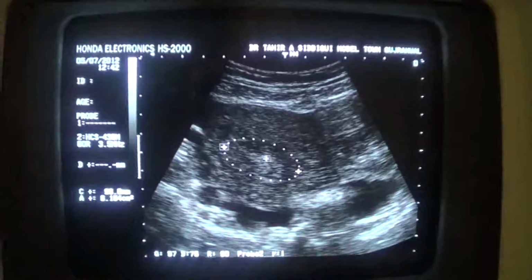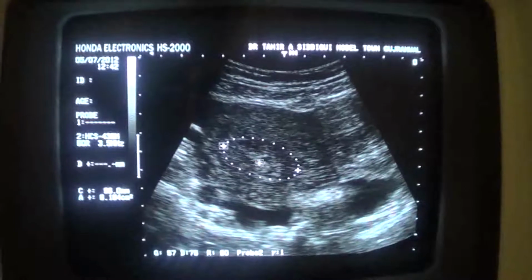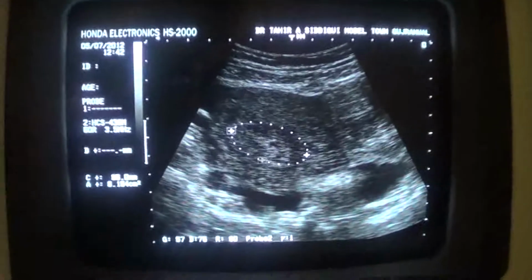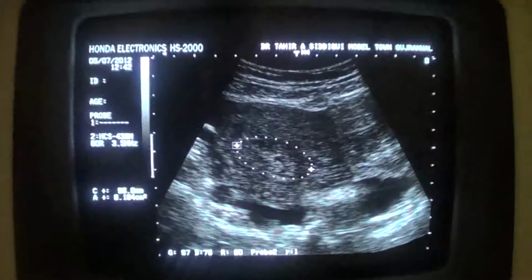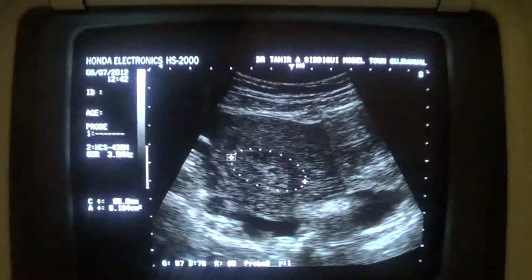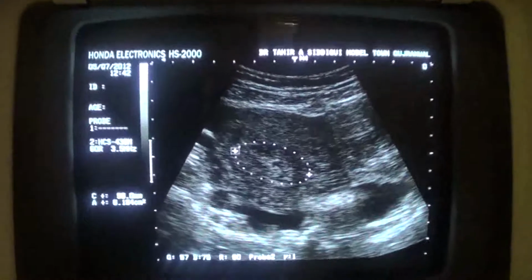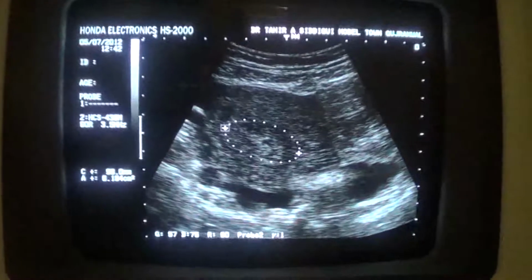It contains different strength echoes within it, bright echogenic areas with no posterior shadowing. However, there is no shiny or strongly echogenic part that, if present, would have been consistent with RPOC.